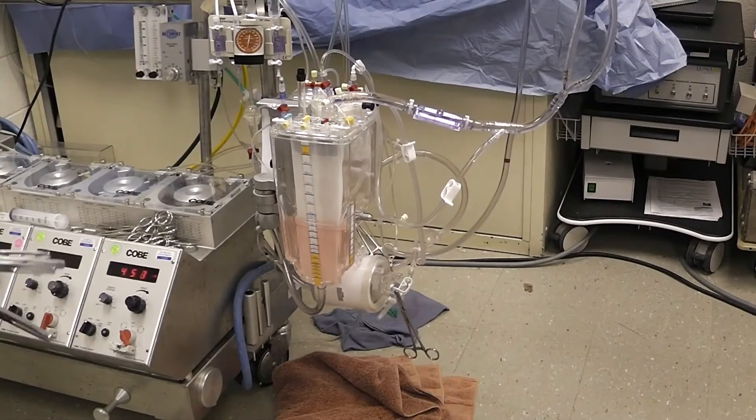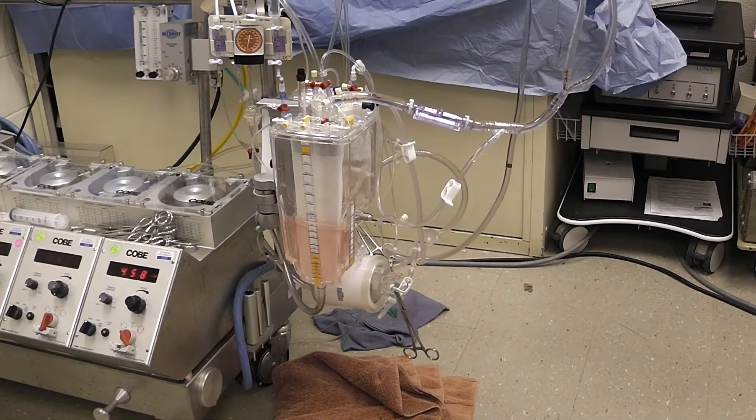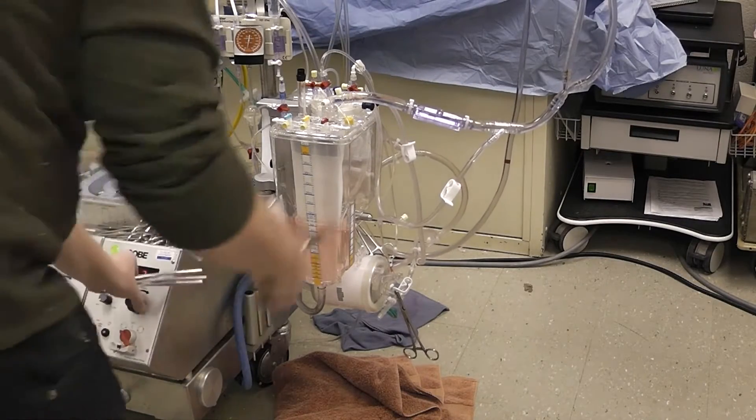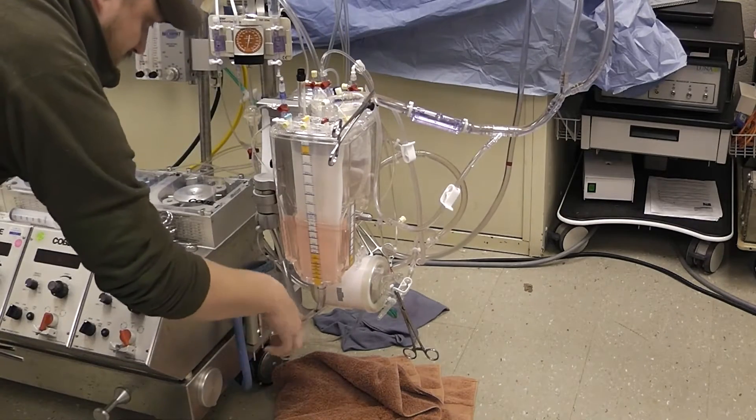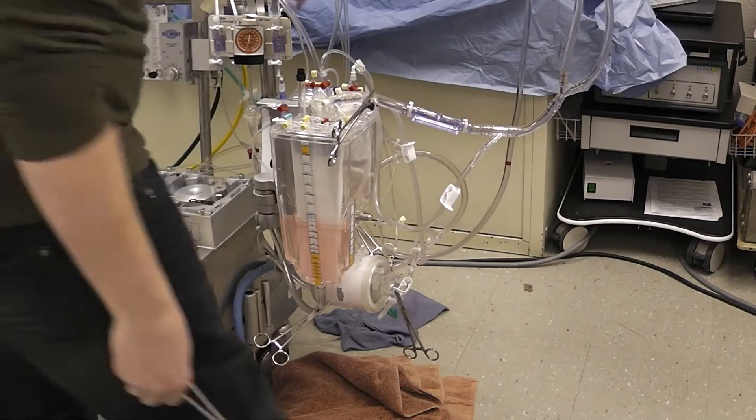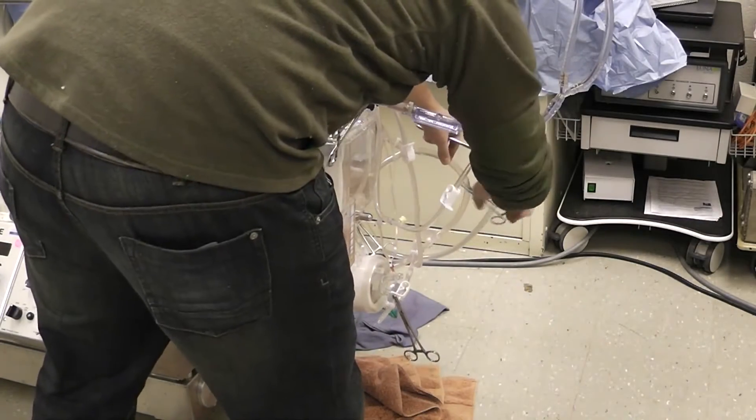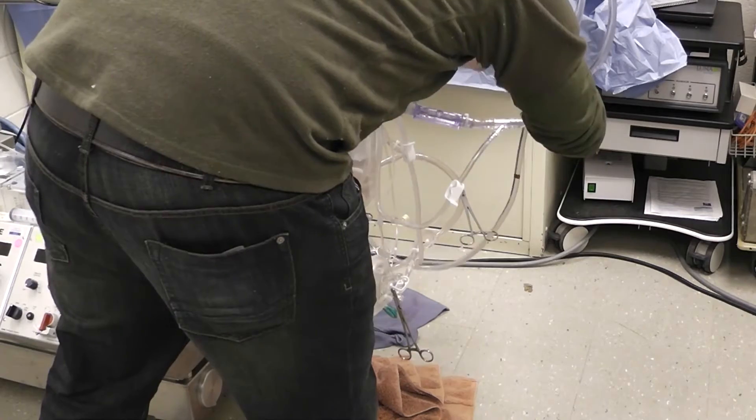So here we are, we're on pump and all of a sudden our pump head ruptures. We immediately need to shut down the pump, clamp the venous line proximal and distal to the reservoir, and clamp the arterial line proximal and distal to the arterial line filter.